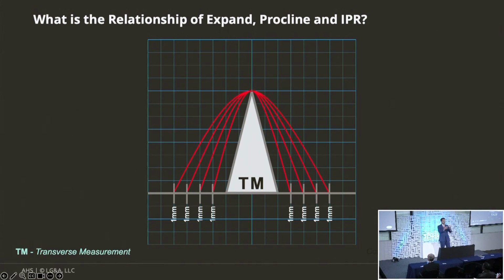So basically I'm just showing you millimeter increments of 3 and 14 moving apart, and a new arch length that's happening every time you move the back teeth wider or farther apart. You've got this new arch length and form happening. So the simple statement is that, well, with every single millimeter I move wider, my arch length is growing. Every single red line is longer than the previous. Okay? Every single red arch is bigger and bigger and bigger. So this is getting longer. Well, obviously, if you have a longer arch to work with, your crowding is going to go away.